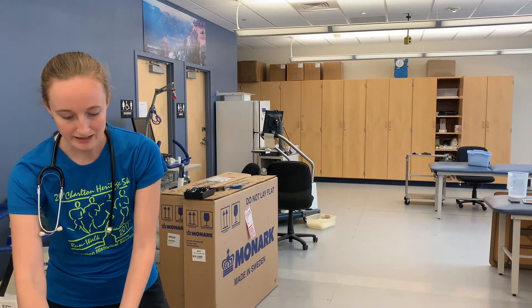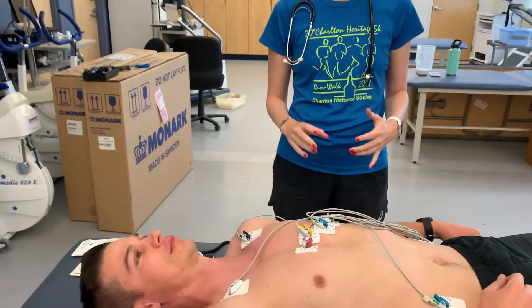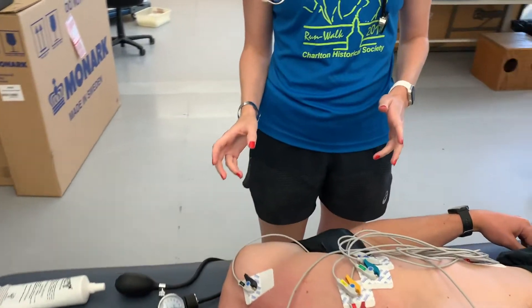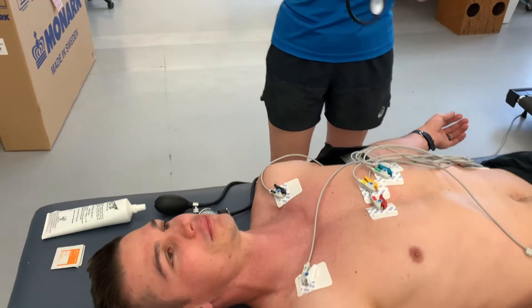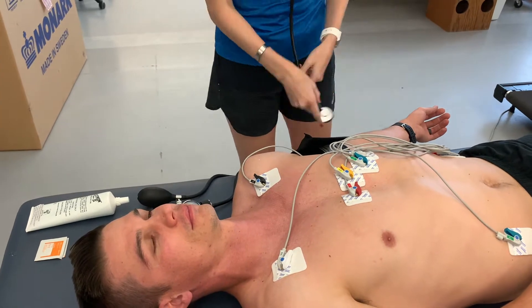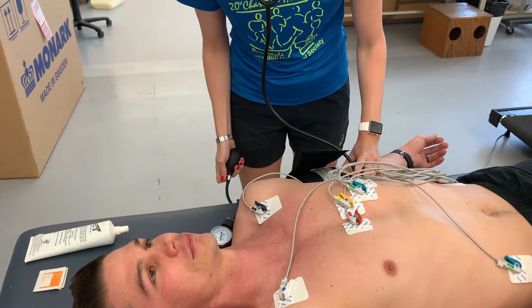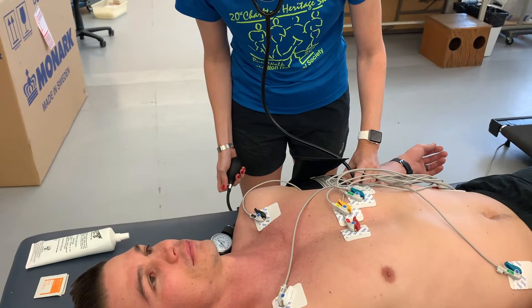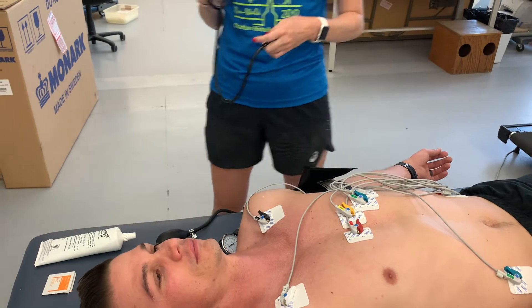I'm going to go ahead and take a resting blood pressure while he's laying supine. It's important that your subject has been laying for about three to five minutes prior to taking this resting measurement, but he's been laying here for a good amount of time. We got 132 over 80.